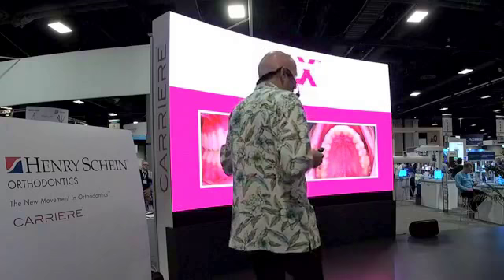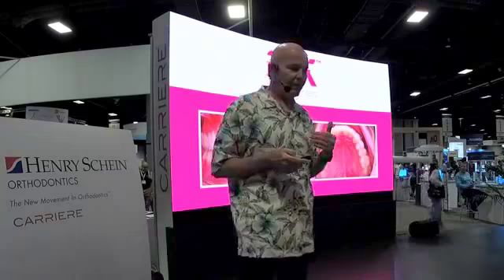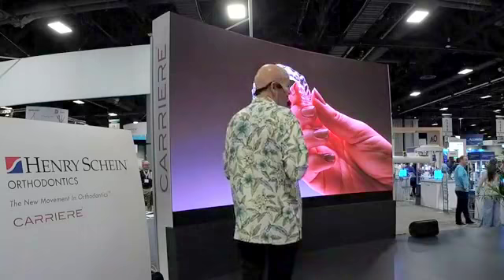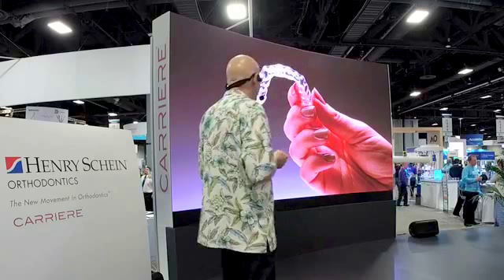Now that we have other options for aligners, we can use our intraoral scanner to have aligners manufactured. We now have SLX clear aligners here at Henry Schein. The nice thing about these aligners, as opposed to the ones that we've all been using, is they are crystal clear — because of the manufacturing process, there are no striations and no attachments. When the patients are wearing them, you cannot see them in the mouth. A couple of the folks here in the booth are wearing them, and my guess is he's already talked to them and didn't even know they were wearing these aligners.